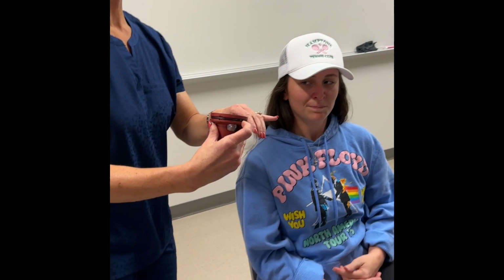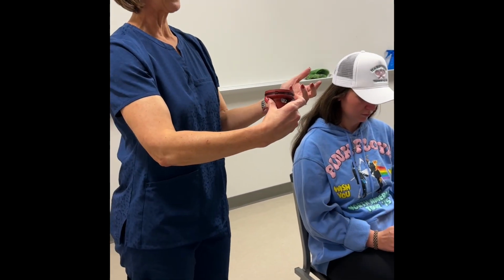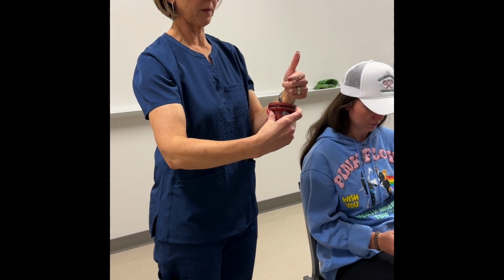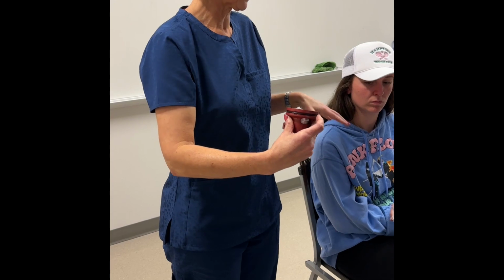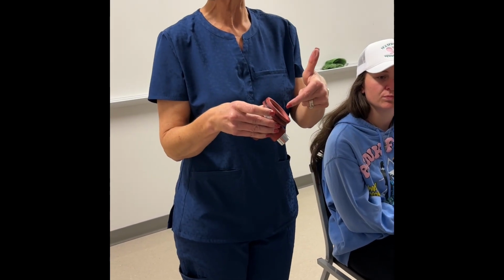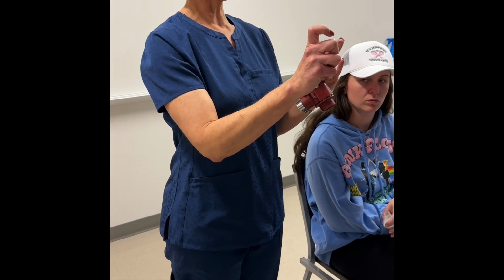So what I did, when that minute was over, back to your filter. When the minute was over, I turned it off now so my hands can't move anymore. She breathed 10 times during this. And the reason I know, I didn't really watch her chest, I watched how many times this rotated. Every time it rotated was a breath. So, everybody ready to do some calculations?